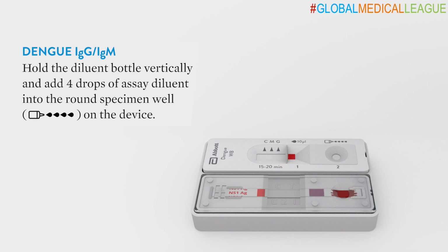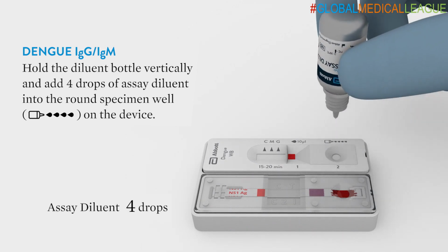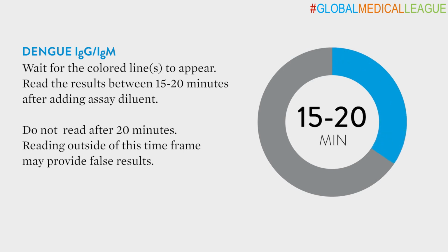Hold the diluent bottle vertically and add 4 drops of assay diluent into the round specimen well. Wait for the colored lines to appear. Read the results between 15 to 20 minutes.